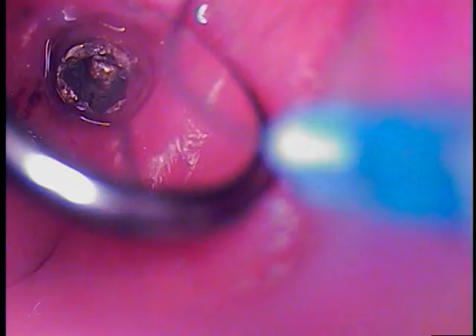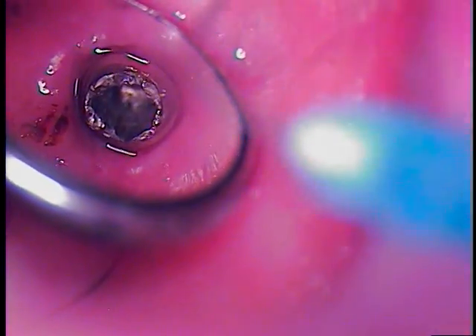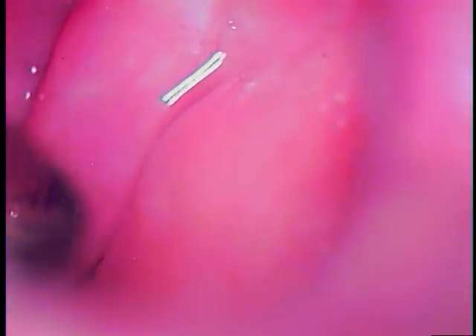Right now we're finishing that up. I'm going to pre-soak the area first, as I did earlier. This is just tartar and stain, but basically its job is to prevent any particles from staying in there. We're not really seeing any changes in color at this point, so we're going to just rinse that out.